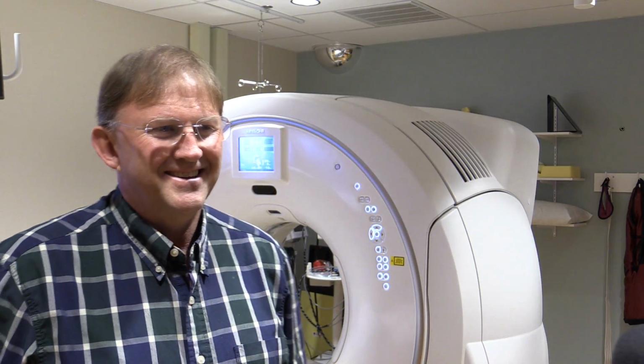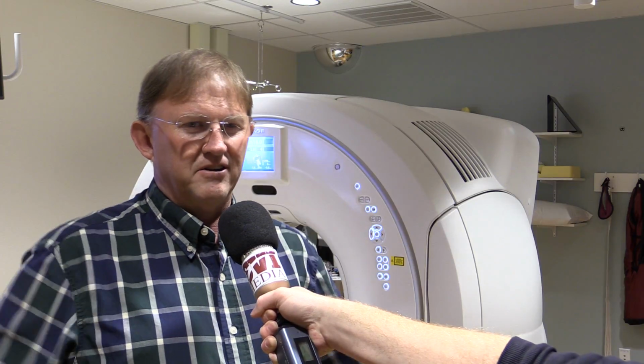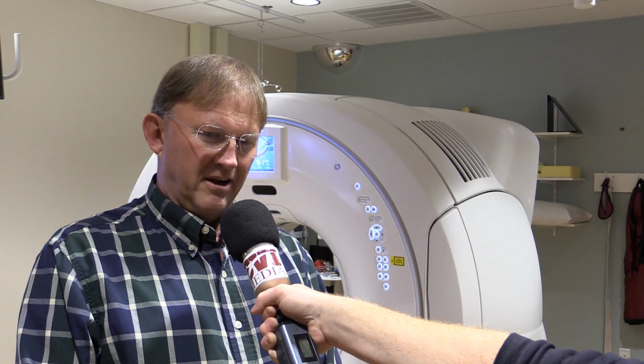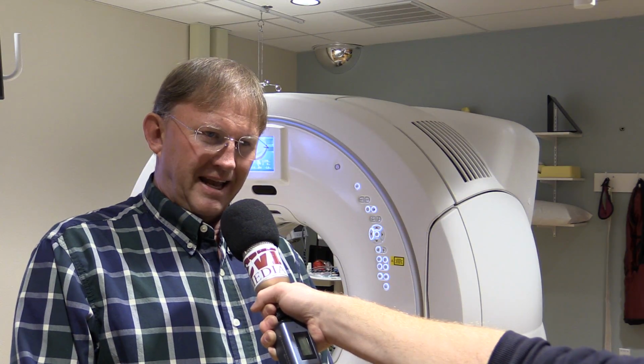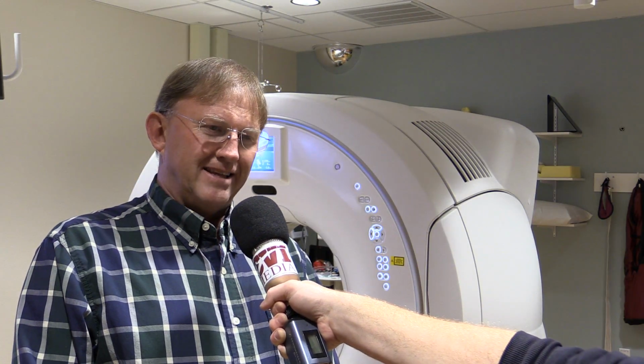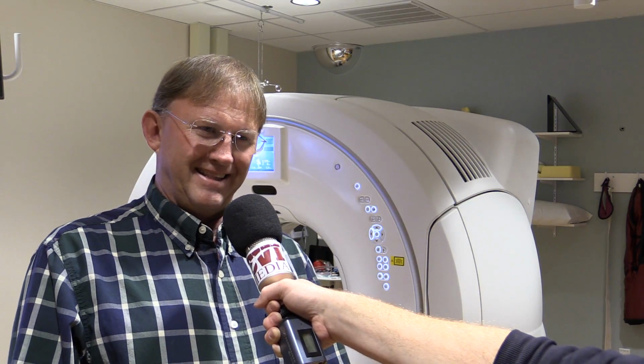Really, really great stuff. Terry, as you described that, I can't help but think about when you first started to get into the medical field and the advancements in technology. Compare this scanner to maybe the first one you used, and describe to us the advancements in this process. I've been doing this 30 years, and when these CT scanners came out in the early 70s, it would take 30 minutes or so to get an image, and it was all pixely and grainy, and just really an awful image, but we thought they were pretty great at the time.